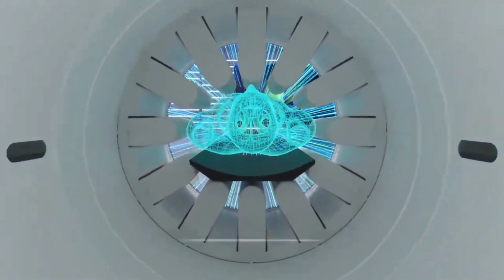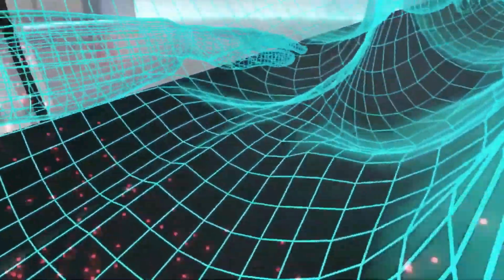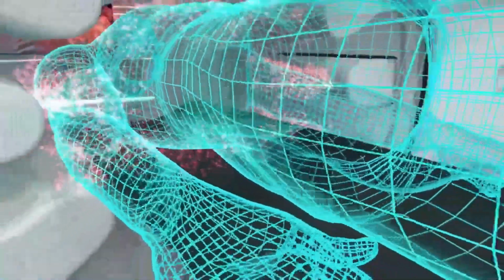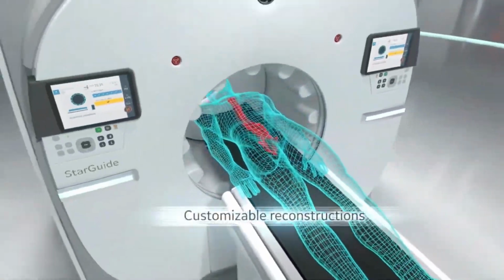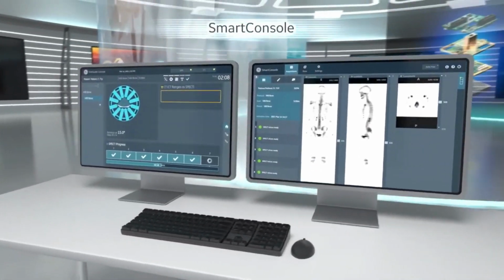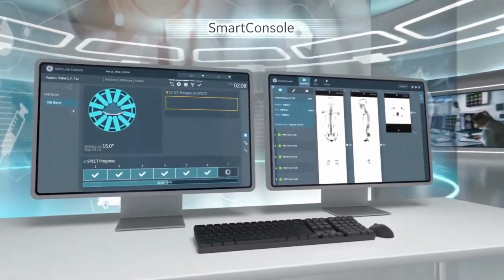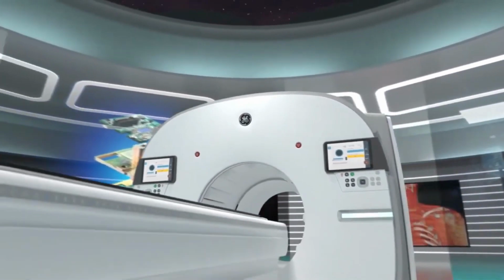The radioisotopes typically used in SPECT to label tracers are iodine-123, technetium-99m, xenon-133, thallium-201, and fluorine-18. These radioactive forms of natural elements will pass through your body and be detected by the scanner. Various drugs and other chemicals can be labeled with these isotopes. This was the simplified video on gamma camera machines in the medical field.